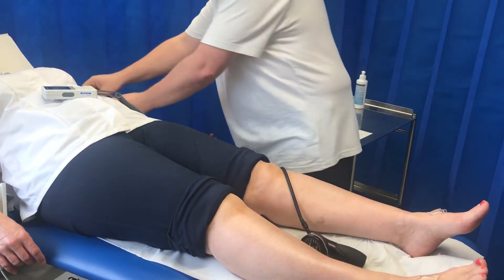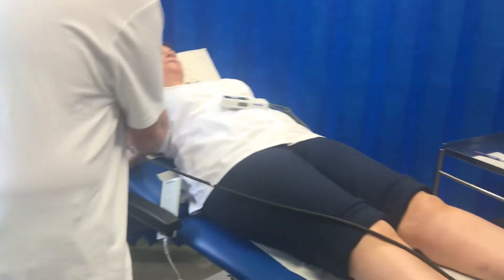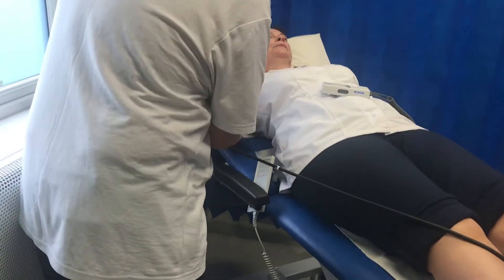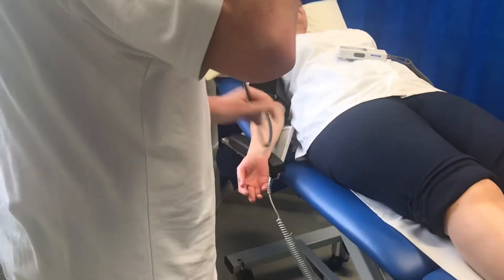I'm going to take the cuff off. I'm going to repeat the procedure on the other arm, because we need to calculate both brachial pressures. We will be using the higher of the two brachial pressures in order to calculate the ankle brachial pressure index.